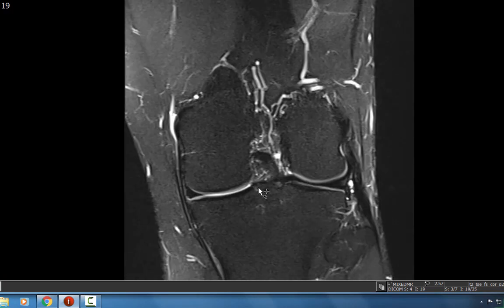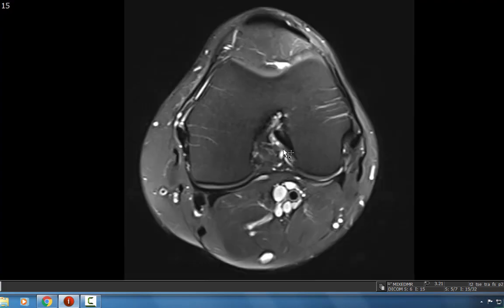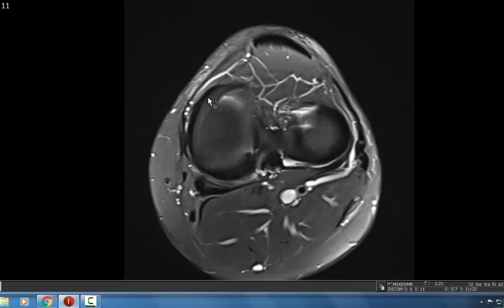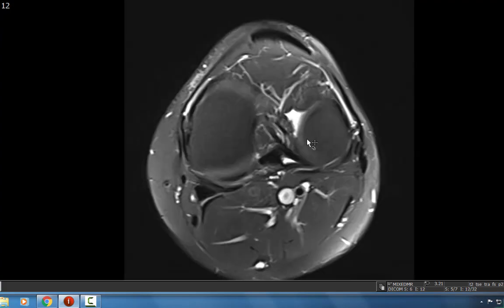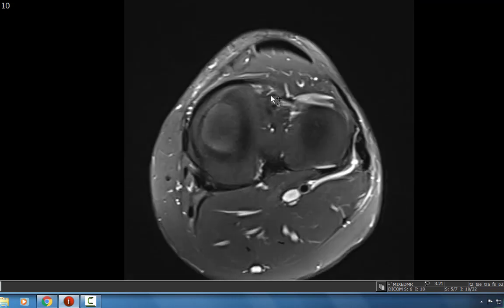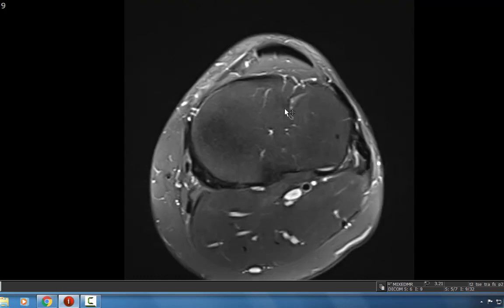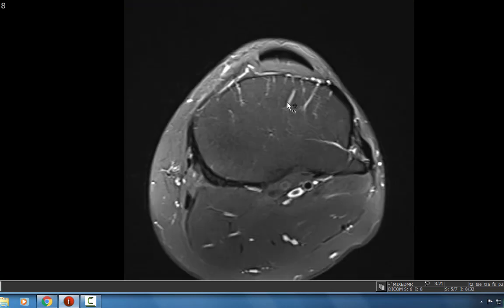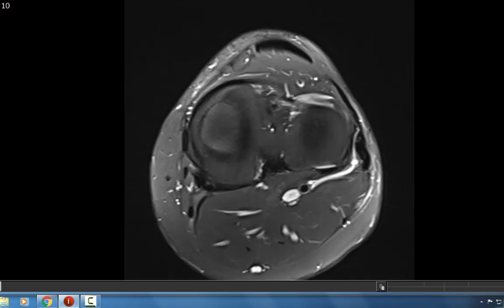You can also look at the menisci on an axial sequence, looking for that nice C-shaped meniscus. This is the lateral meniscus — it's a little smaller — and here's the medial meniscus. Sometimes you can see the transverse ligament, which bridges the anterior horn of the lateral meniscus to the anterior horn of the medial meniscus, though we don't see it here.